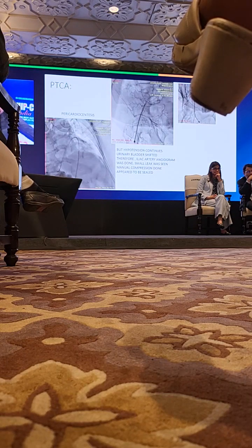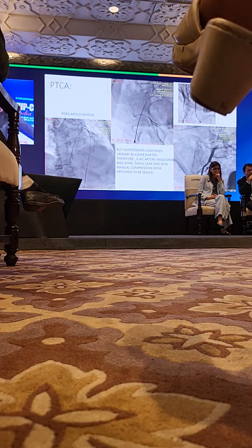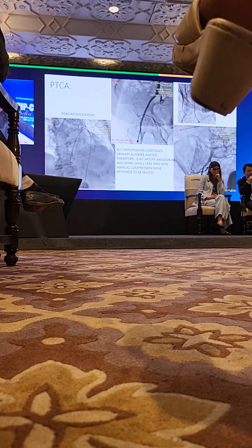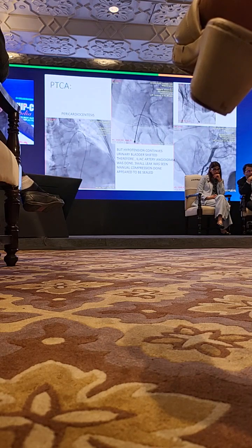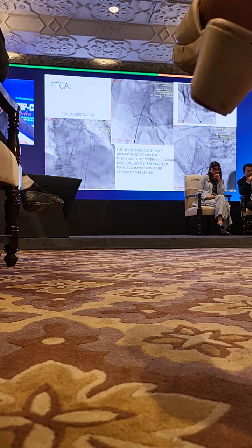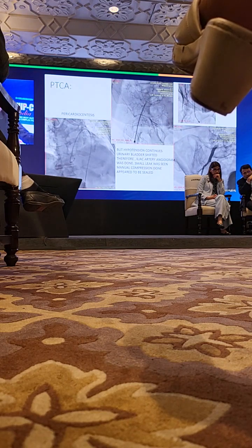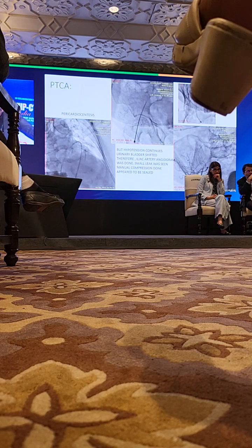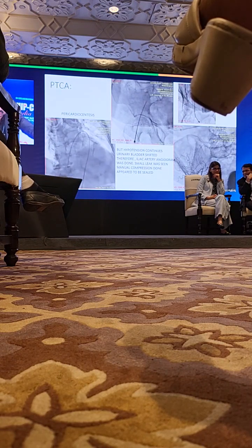Now what happened when the patient went into cardiac arrest and CPR? My fellow was trying to put the temporary pacemaker because the patient had a cardiac arrest. He placed the needle, and for the pericardial tamponade, the pigtail was placed. Now you can see that indented urinary bladder sign which was seen.